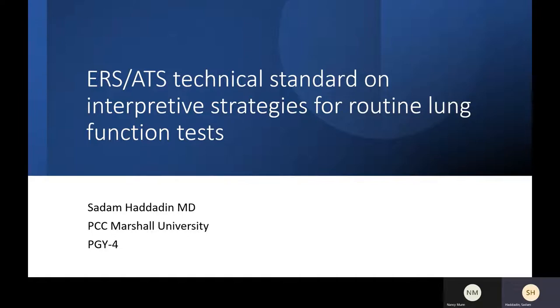We are likely to underdiagnose obstructive, especially obstructive lung disease, because we're talking about spirometry. We're not talking about lung volume. Spirometry is diagnostic for obstructive diseases. It's suggestive for restrictive, but not. Anyway, for obstructive lung disease, you will miss many abnormals in the young age if you take our data. And you will diagnose many olders.